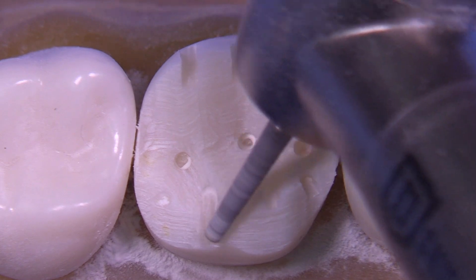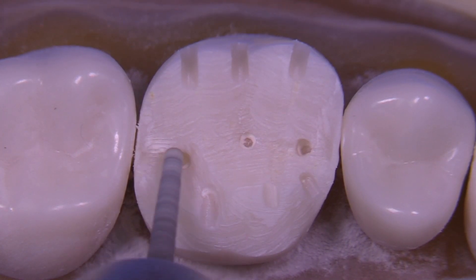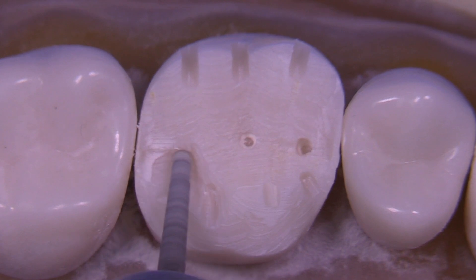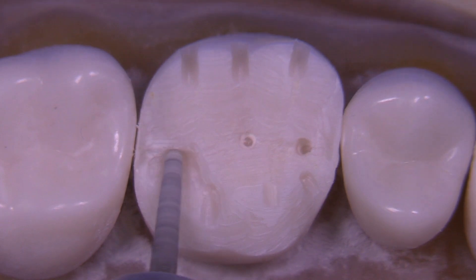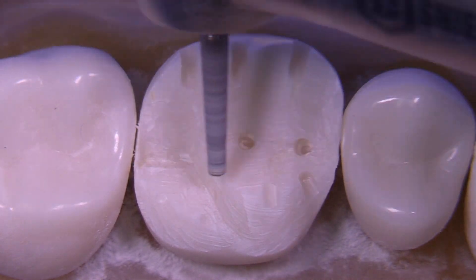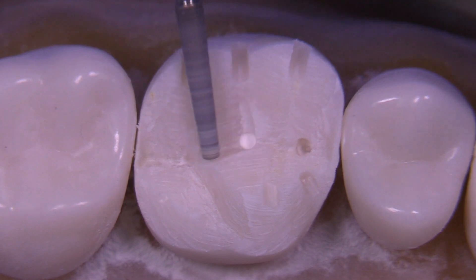If you've been following me on YouTube for a while, you know that I have many different approaches to preparing teeth. The reason for that is everyone works a little bit differently. People need to find a technique that they're comfortable with that is reproducible, repeatable, highly competent — and then go with it. So I'm just showing you another one of many different methods to reduce preparations.